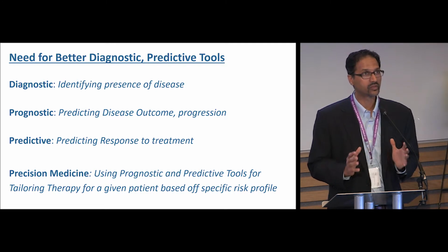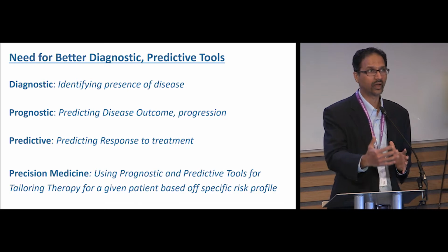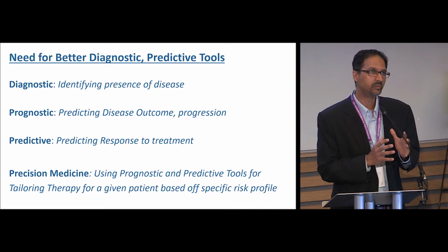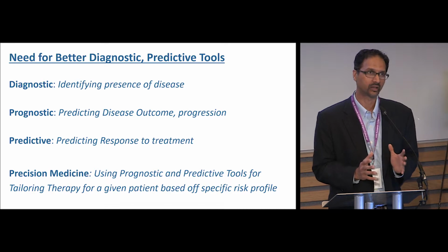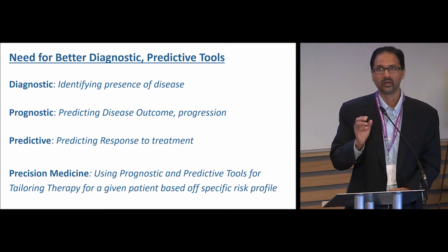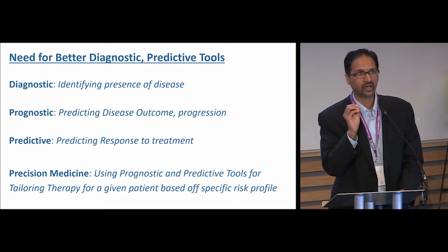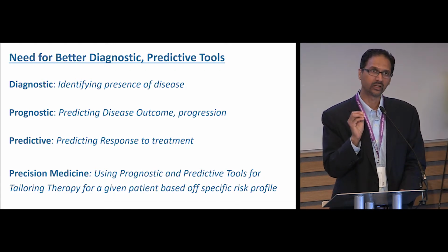And yes, there's a lot of interest centered around identifying which patients might have disease progression, who is going to have metastasis. But perhaps even more than prognostic predictions is the ability to create predictive analytics, so predictive companion diagnostics. From an oncologist standpoint, these are really critical because they allow for clinically actionable information on how to manage therapy for a given patient.